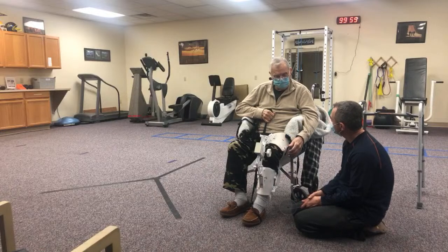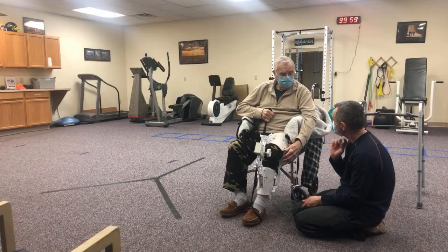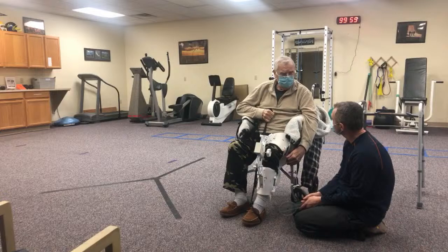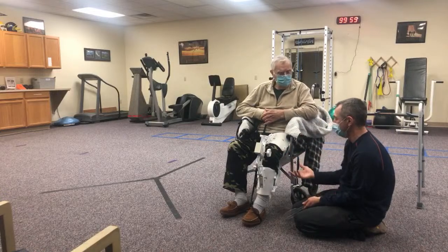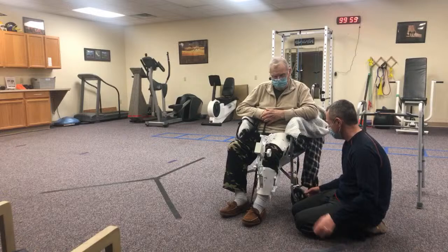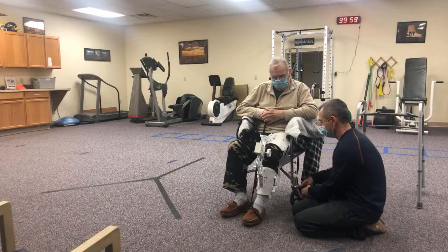Last week I could bring it back to 77 on my own. Then when the therapist worked on it, we went from 77 to 83 - that's where we held it at 83. Just 75 right now without much agony is good. I'm just going to turn this wheel - you stay right there.